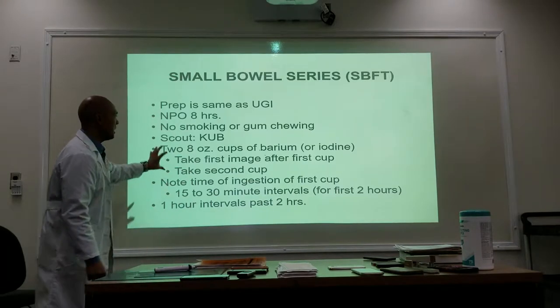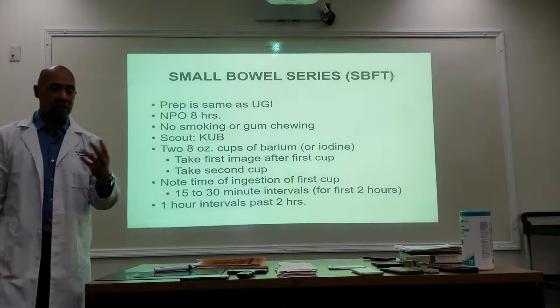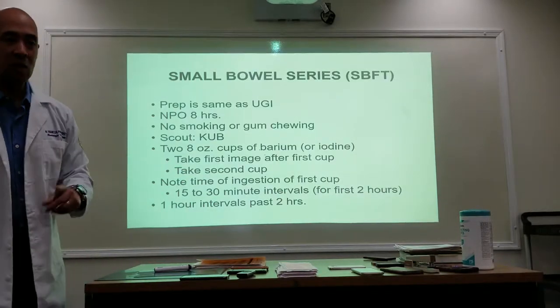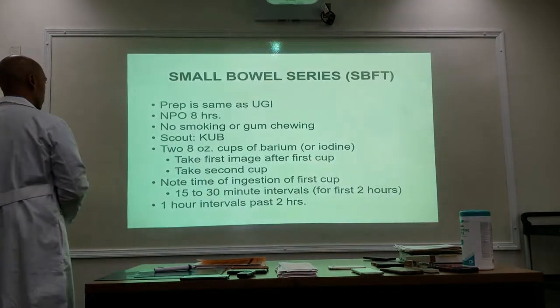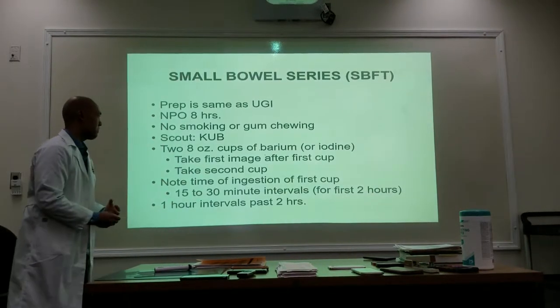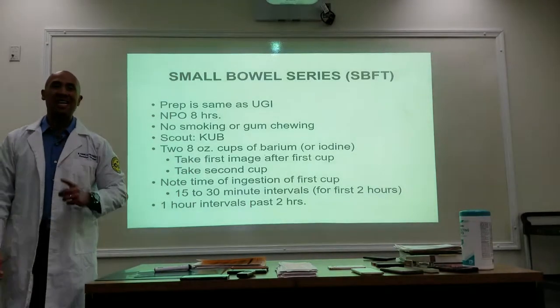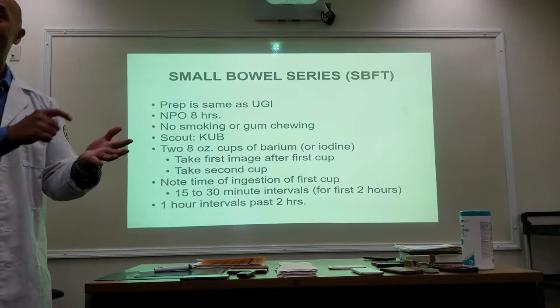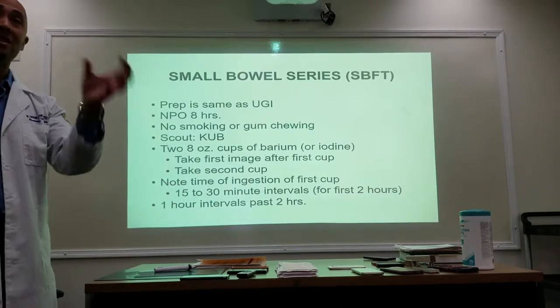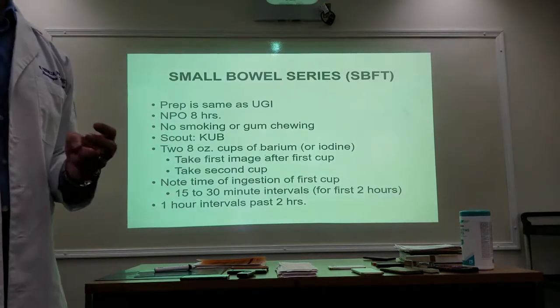All right, so we're going to take a scout, show it to the doctor, share the history with the doctor, and then let's say, okay, go ahead and begin. So when you go back into the room to begin the procedure, you're going to give them their first 8-ounce cup of barium. And again, start timing the moment that they start drinking the barium. You got to note the time that they start drinking the barium.